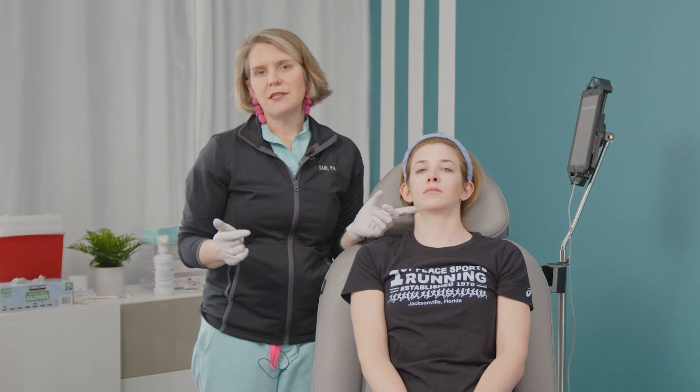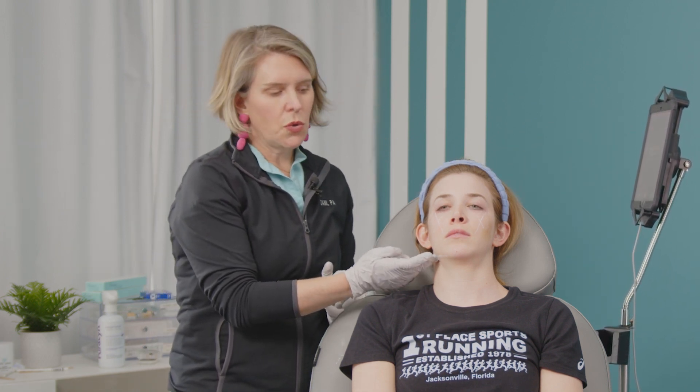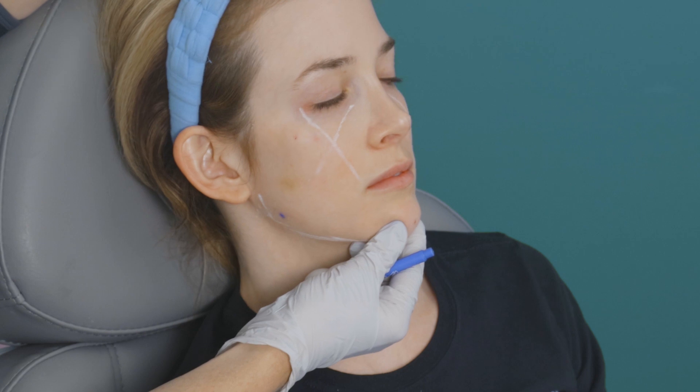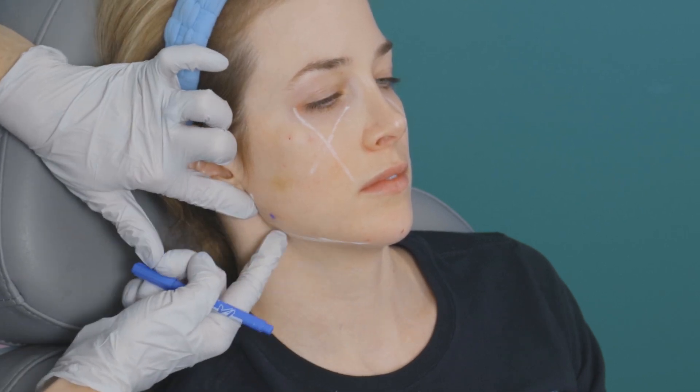But in the gonial angle, a lot of times there's not much in the way of vasculature — but sometimes there is. So this is just a way to do that extra safety check, where you can take a look under the skin and find out if the spot you want to put filler in is okay to inject. Especially with non-dissolvable fillers placed in the gonial angle, this is a great way to check for safety. So we start with the clinical question: is this spot right here safe? I use a surgical skin marker — you can see right here using these markers — to visualize exactly where the gonial angle is.